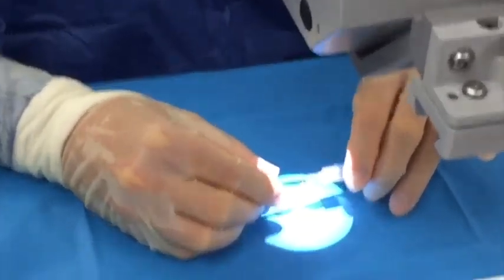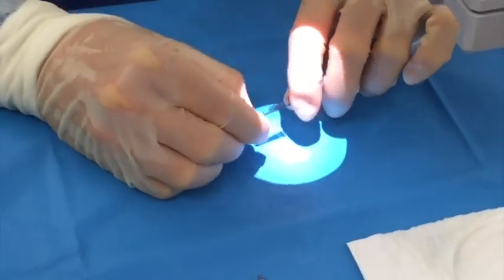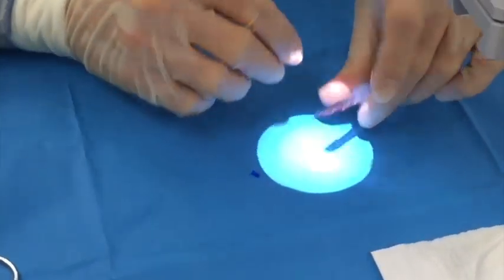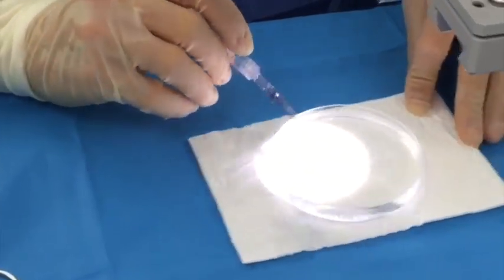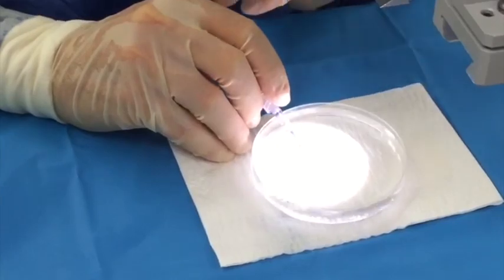Next, the protective blue cap is removed from the tip of the Stryko Jones DMEC tube and discarded. After attaching the Stryko DMEC injector, I like to rinse out some of the Optisol from the injecting tube into a petri dish full of balanced salt solution. Generally the graft is freely mobile and you must take care not to eject the graft.